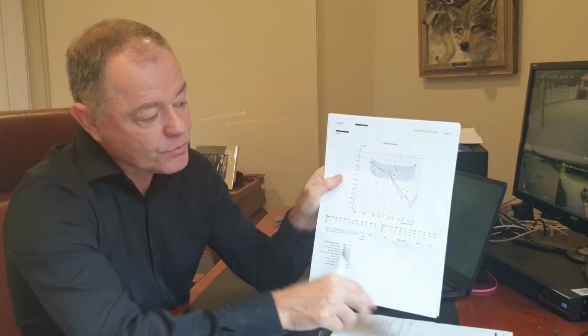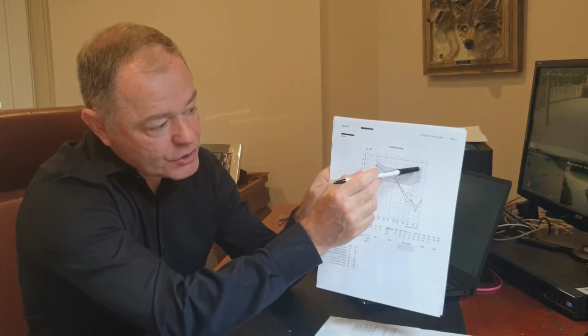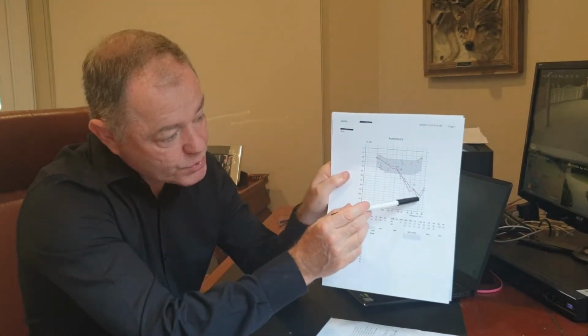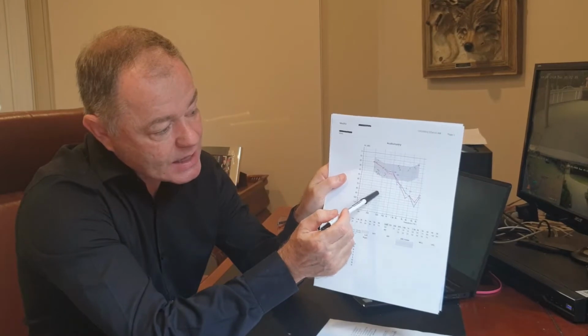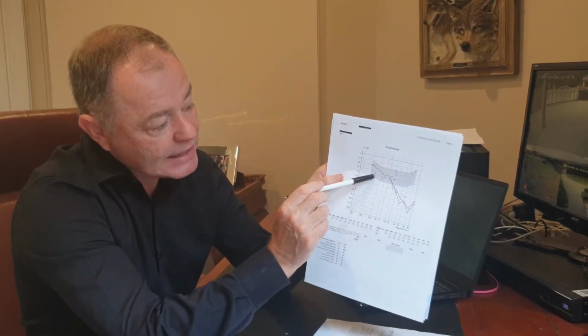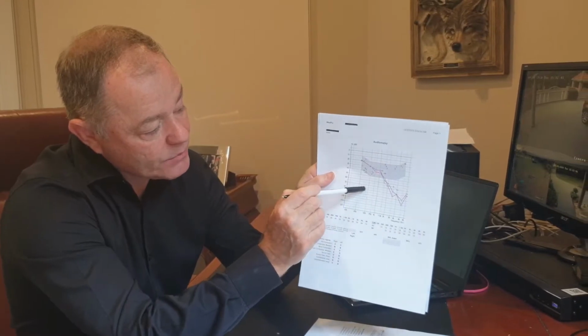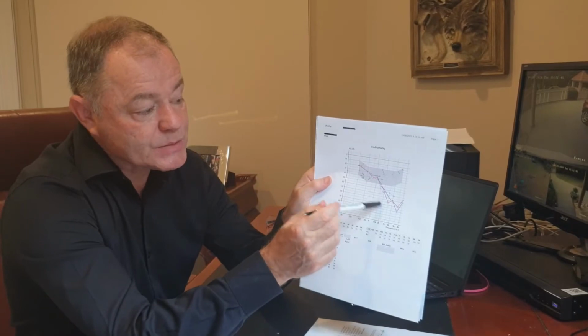Now, in contrast, if we have a look at this particular graph, instead of it just being isolated on the extreme high frequencies, this graph drops away much earlier, right in here in the mid frequencies. And so even in the mid frequencies, you've got at least a 40 decibel loss, and then that very rapidly drops again away down here to around about 60 or 70 and further. So this person is experiencing a lot of trouble.